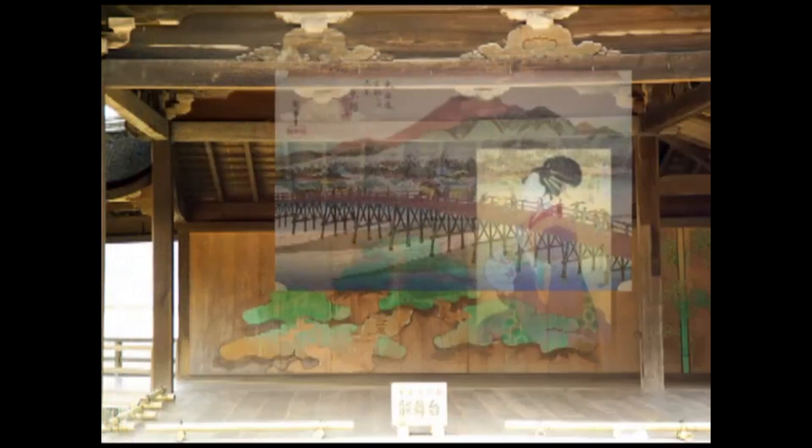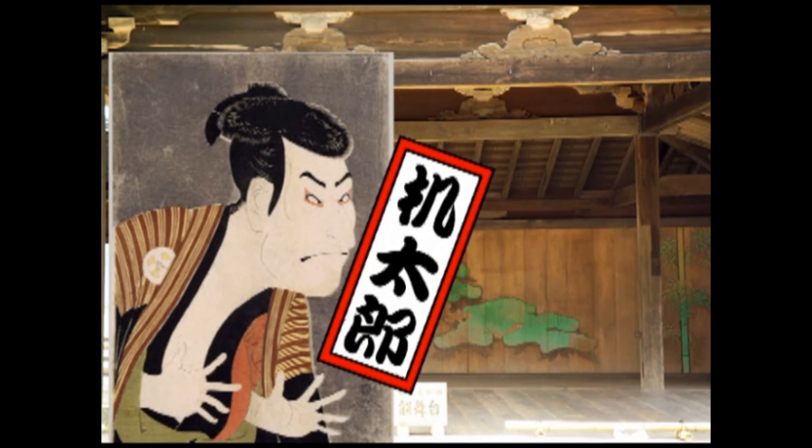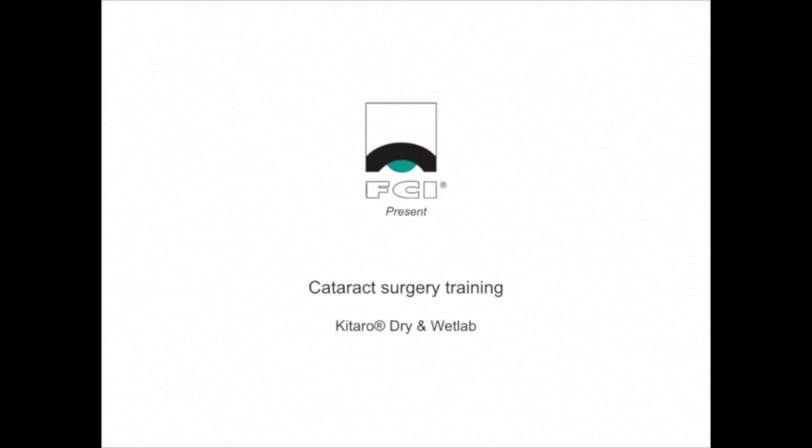We would like to introduce a revolutionary training system for practicing phaco surgery called Kitaro, developed in Japan. The Kitaro system consists of two types of training kits: Kitaro Dry Lab and Kitaro Wet Lab. First, we will explain about Kitaro Dry Lab for practicing phaco surgery at a desk without using a phaco machine and an operation microscope, prior to Kitaro Wet Lab.